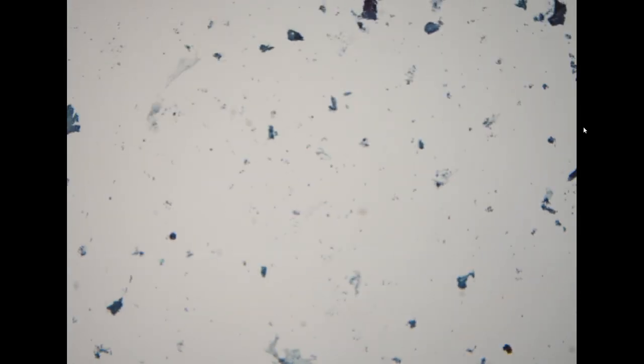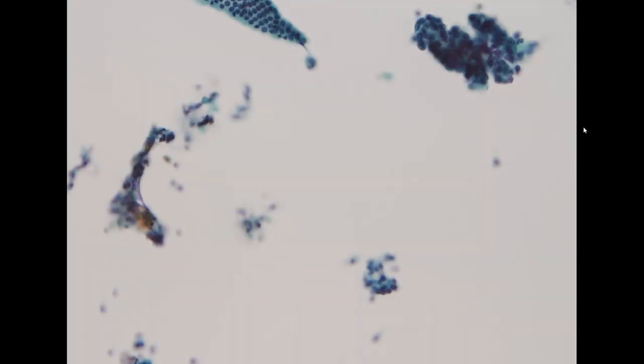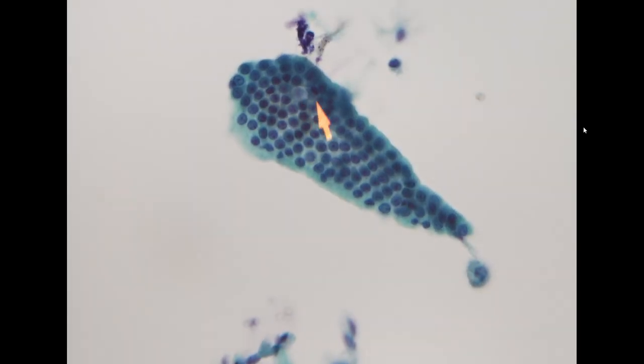So let's move to EUS-guided fine needle aspiration. We have two pancreas cancers today. For the EUS, it is common that you will sample some benign intestinal mucosa. So you can see there is a goblet cell over here. If you adjust the focus, you can see the mucin vacuole on top of the nucleus. So this is coming from the duodenum.